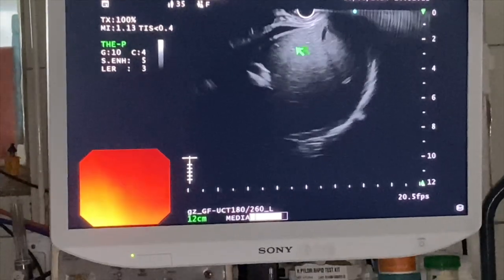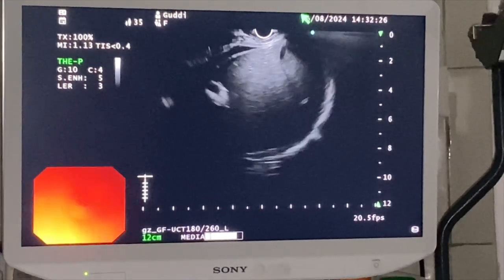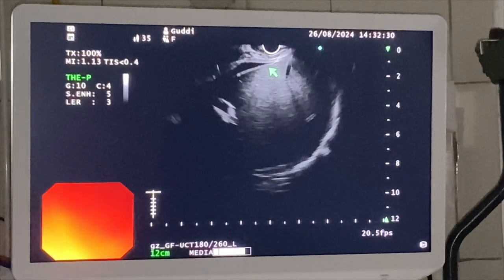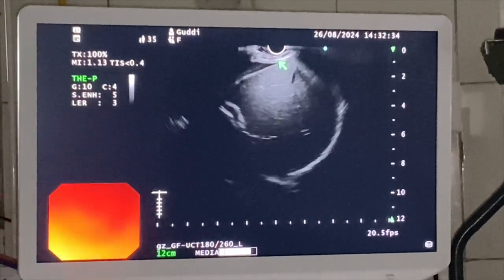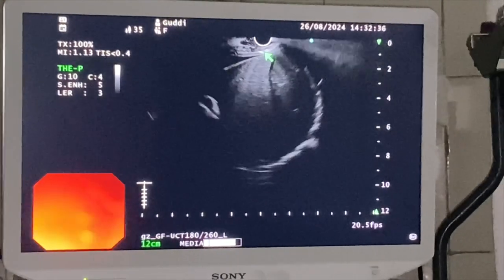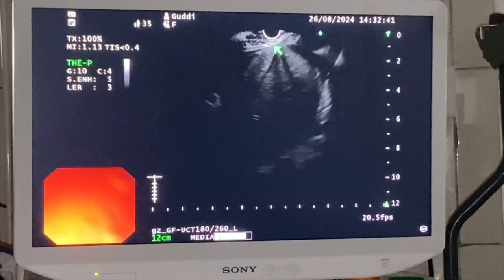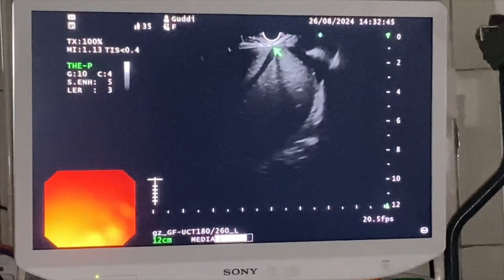See, this is the dilated portion of the infrahepatic abdominal compartment. This is the suprahepatic compartment. This is the intrahepatic compartment, in which the IVC is a little bit narrowed. So in this narrowed segment, the first vein to identify is the right hepatic vein.